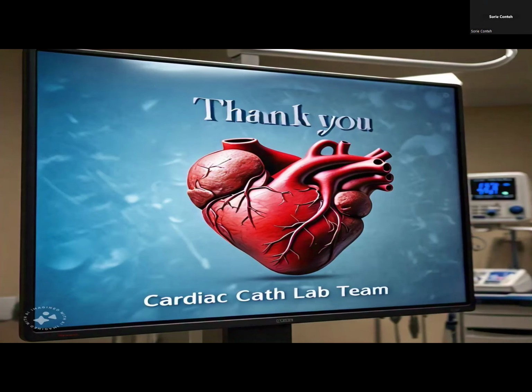And after that, you position the arm, usually by the side of the board, and you also make sure that the wrist is hyperextended, especially for the left hand.